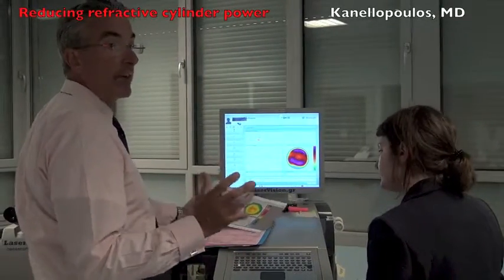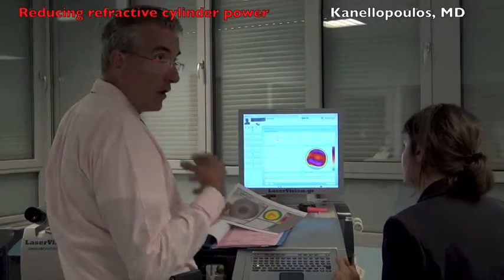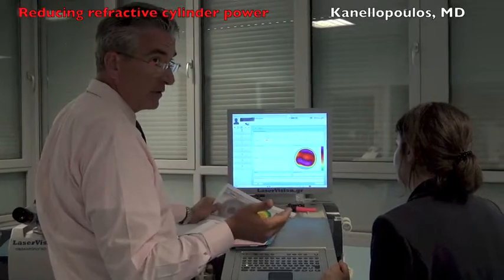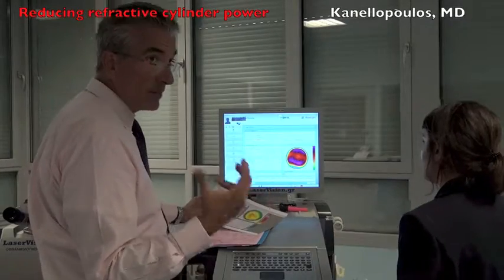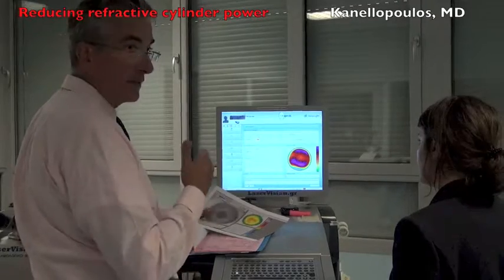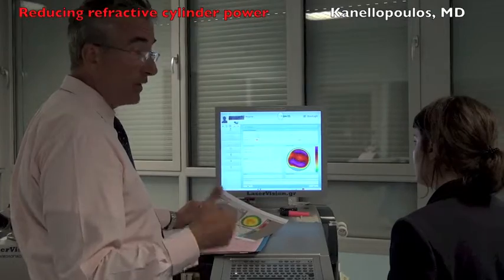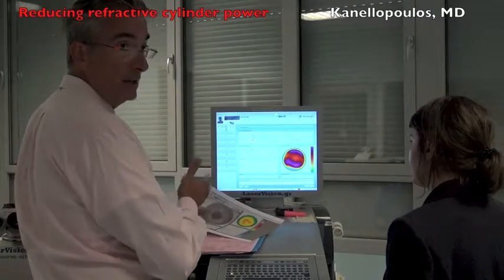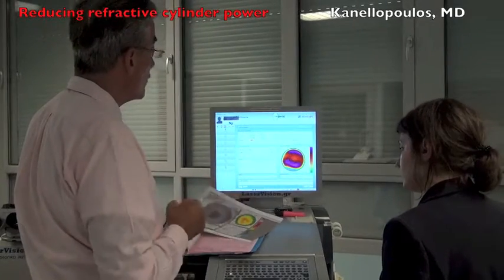Of course, the majority of cases are going to be like the one we just saw. The topography customized platform will suggest treating more cylinder than we're refracting. And we know this is happening because there's accommodated cylinder from the lens of the eye neutralizing the topographic cylinder. But we know accommodating cylinder is not stable, and with time will go away, and we want to treat corneal cylinder with topography-guided ablations in order to get a maximal refractive effect.